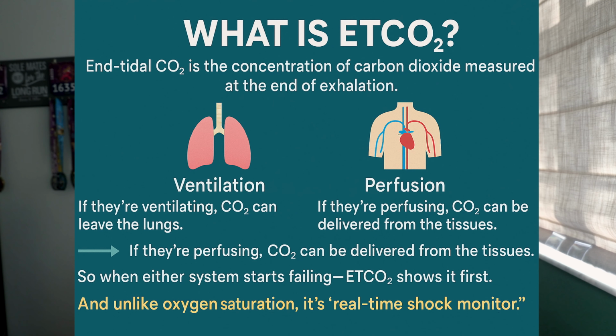So it reflects two critical systems. It reflects ventilation and perfusion. If they're ventilating, CO2 can leave the lungs, and if they're perfusing, CO2 can be delivered from the tissues. So when either system starts failing, end-tidal CO2 shows it first. And unlike oxygen saturation, it's immediate, it's quick, there's absolutely no lag. That's why we call it the real-time shock monitor.